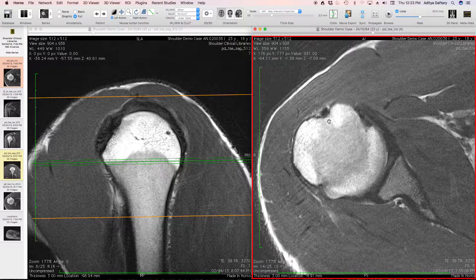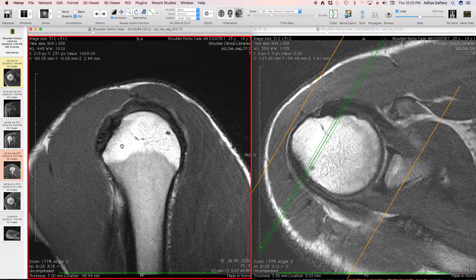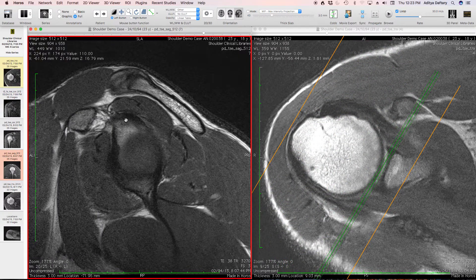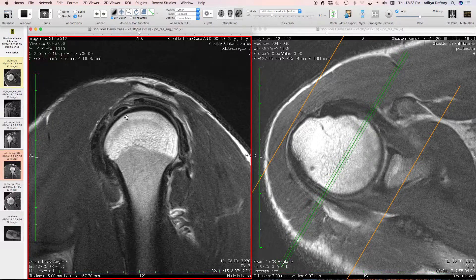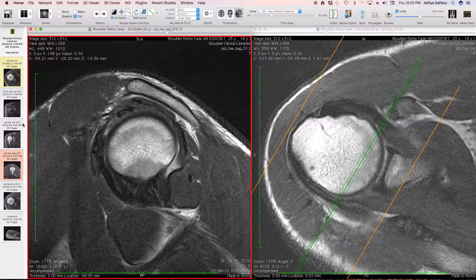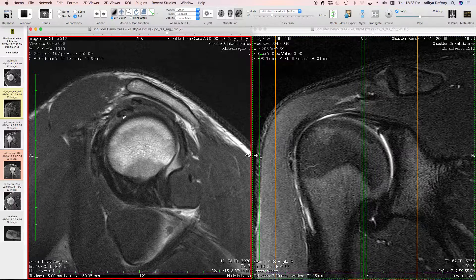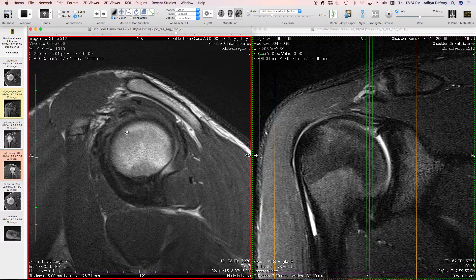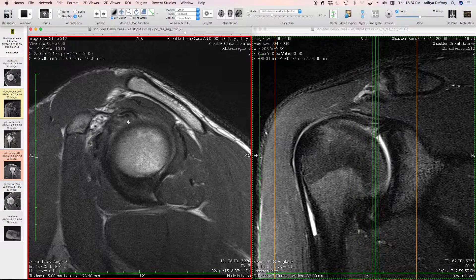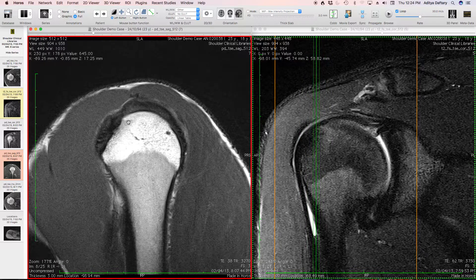Moving on to the biceps: the long head of the biceps sits in the bicipital groove. We can follow it in its vertical portion, then it swings across to its horizontal portion in the pulley region — sometimes a little hard to see — then into its intra-articular portion, which looks pretty good. As we get closer to the superior labral attachment, one can see a split within the biceps, with some scarring and edema visible on the coronal image in the rotator interval region.